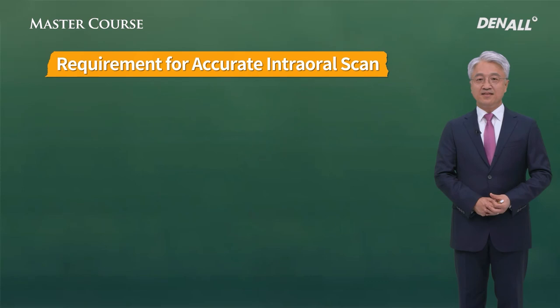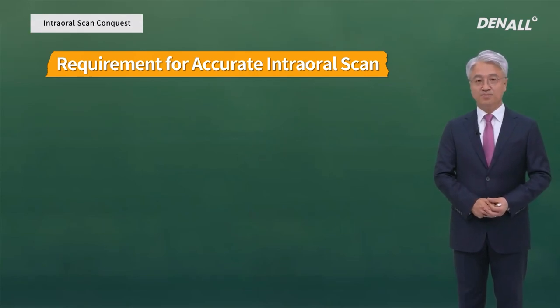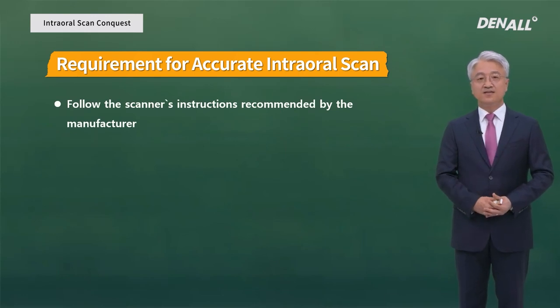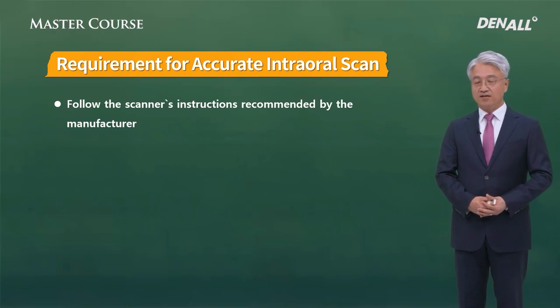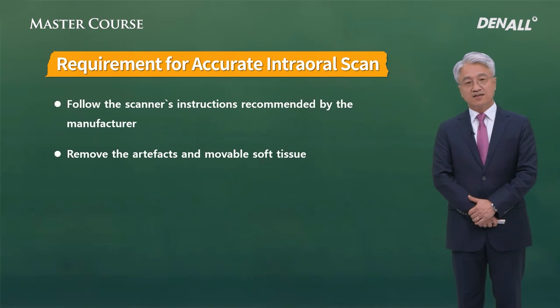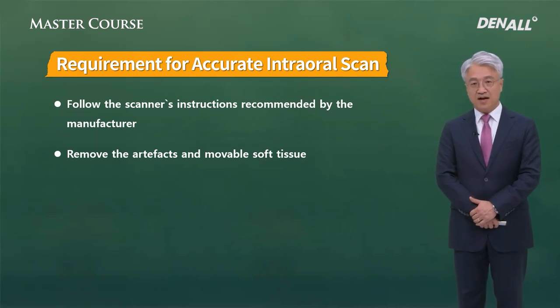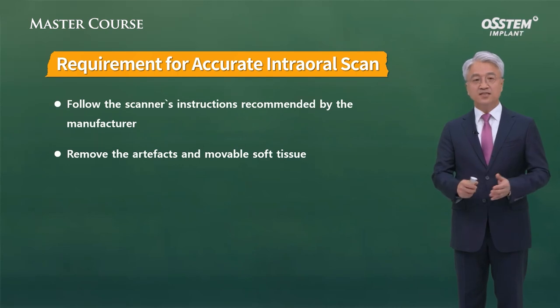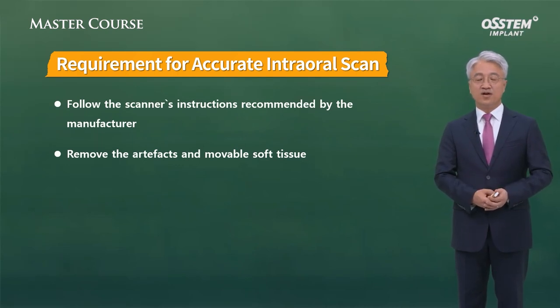Finally, I would like to summarize some strategies to get accurate intraoral scans. First, you need to follow the scanning methodology projected by the oral scanning companies. That is the best way to go. Second, as you do scanning, you need to remove artifacts or flabby gingiva to get an accurate scan bite.